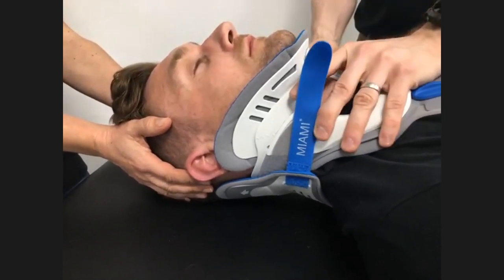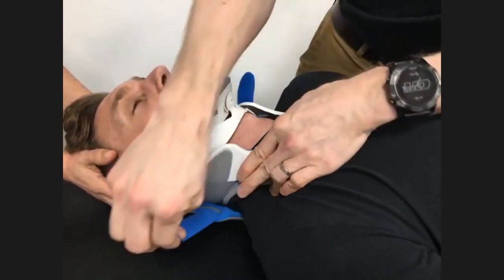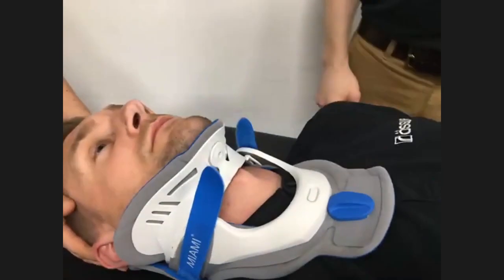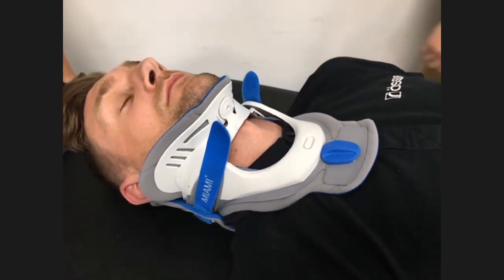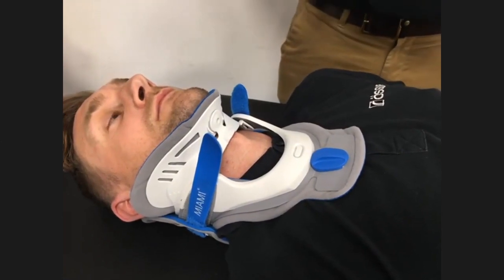So I'm just going to make a few last adjustments either side. Check this. That looks good. And you can see that we've got these two tabs roughly equal, and we've got it nice and symmetrical on the patient. Okay, so now's a good time to talk about some of the different options and some of the different methods we can use.